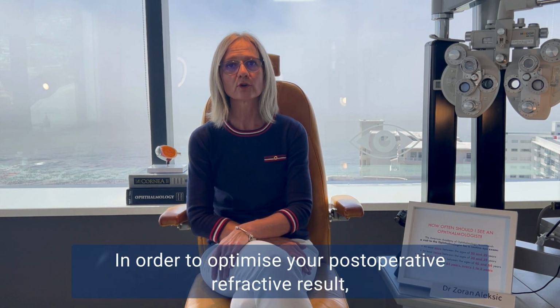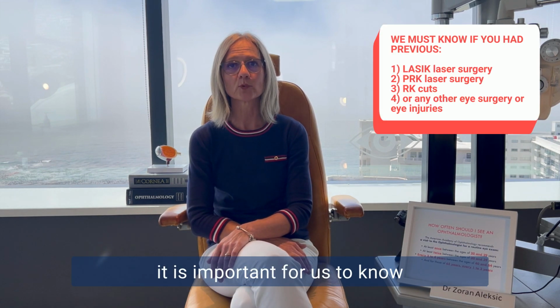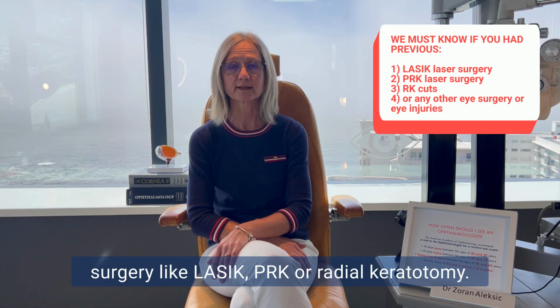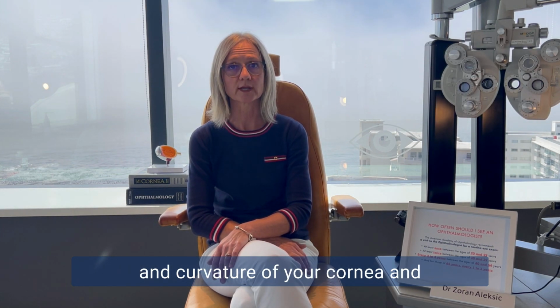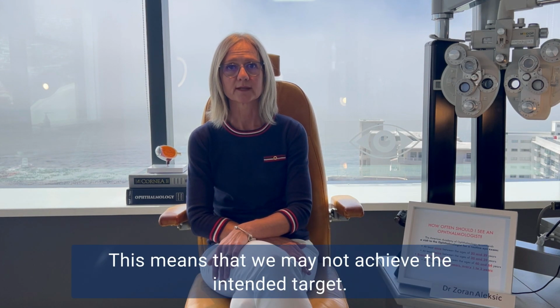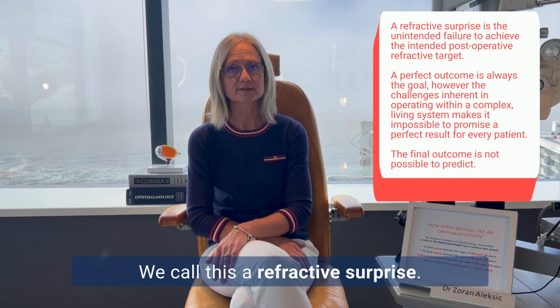In order to optimize your post-operative refractive result, it is important for us to know if you've had any previous refractive eye surgery like Lasik, PRK, or radial keratotomy. These procedures alter the natural shape and curvature of your corneas and make our formulas slightly less predictable. This means that we may not achieve the intended target. We call this a refractive surprise.